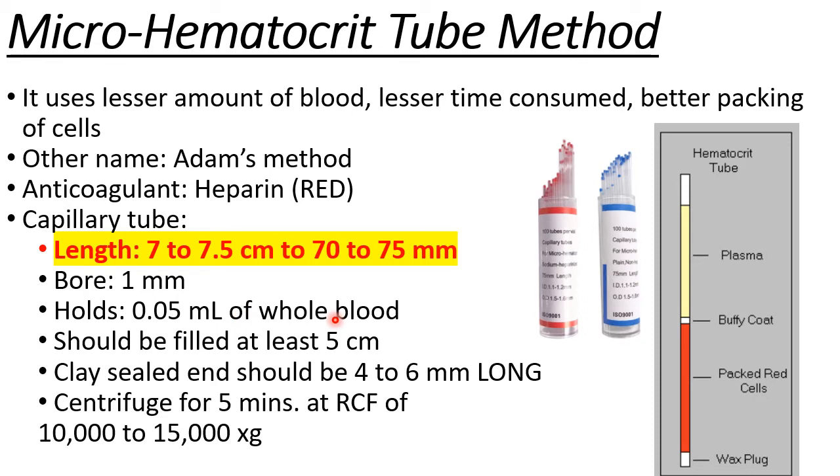Gaano karami ang dapat natin i-fulfill? Dapat hindi sosobra, no? Hindi natin i-fulfill lahat. At least 5 centimeter of blood yung kailangan natin ma-fulfill. So, dapat may libreng 2 to 2.5 centimeter. Okay? And then, for this technique, we will centrifuge the blood specimen for just 5 minutes with centrifugal force of 10,000 to 15,000.